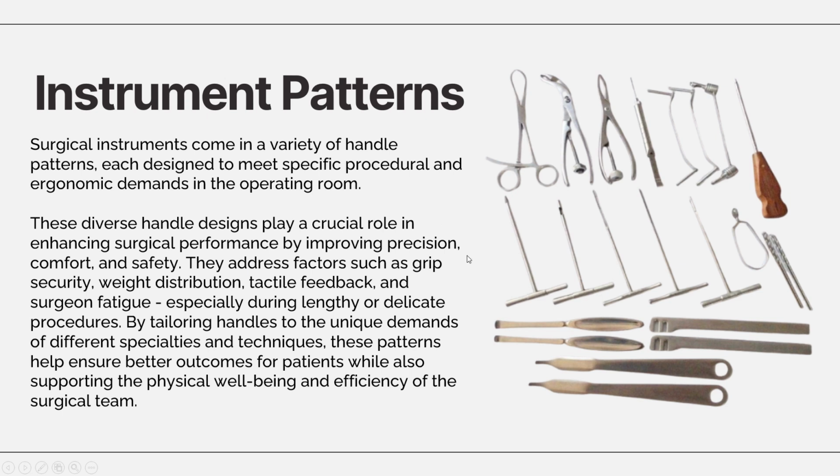There are several factors that engineers have to weigh in when creating patterns. So there are, for example, grip texture, the length, the width, and balance. These are all considered to ensure the instrument performs effectively while minimizing the strain it would put on the surgeon.